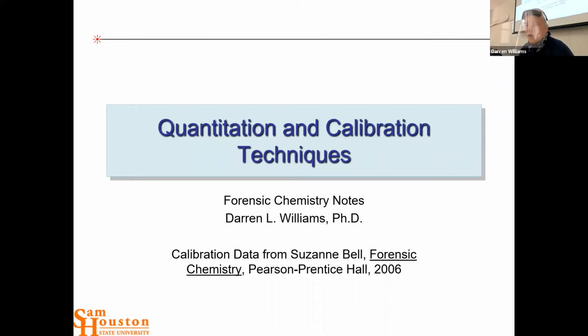And then we'll talk about, because in forensic science, you're going to have a lot of variety of matrices. You know, you might have blood serum, or you might even have like the fluid in the eye, or you've got urine samples. You've got a lot of complex matrices. Now, most of those are aqueous solutions, but there's active agents in there, specifically enzymes.